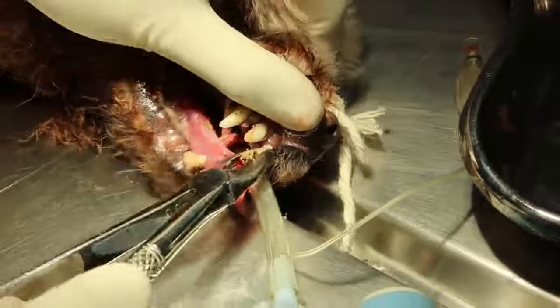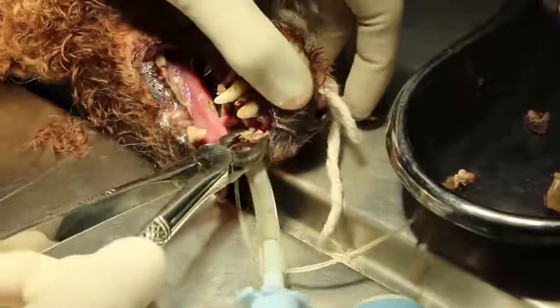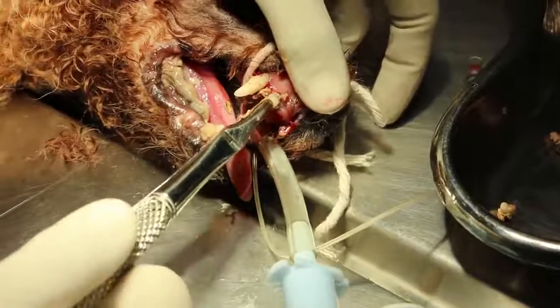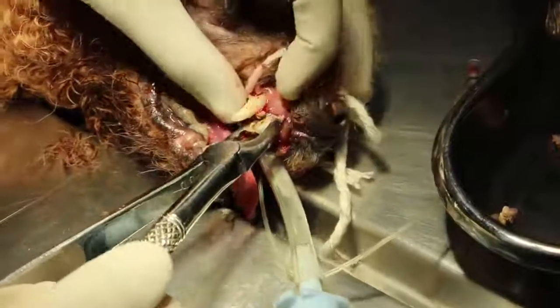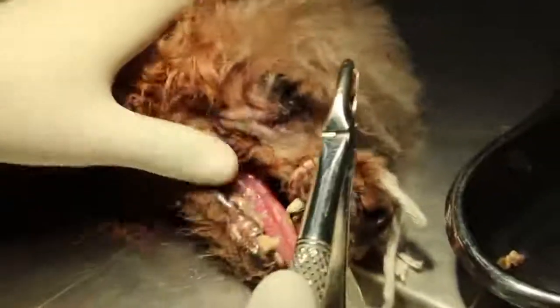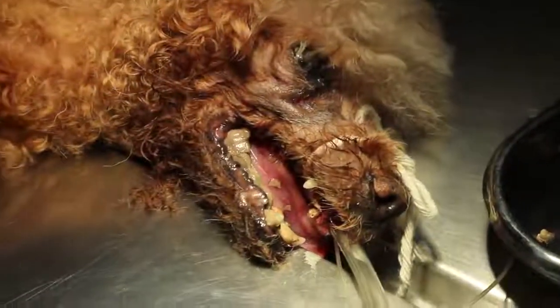Then incisor — probing measurements recorded: 2, 2, 2, 5, 5, 5, 6, 7, 7, 8, 10, 8, 9, 10, 10, 11. Premolar first, okay, we'll turn over.